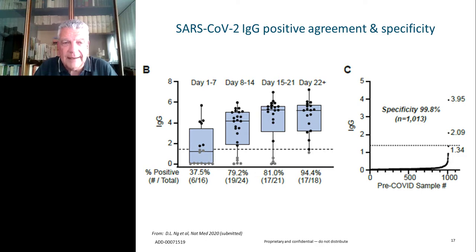This combines the detection according to the weeks after the onset, you see here on the left, and the specificity of another cohort, very similar. And you see that the distribution is the same. The specificity is 99.8%. And again, there is just one sample that is across the cutoff area, which is this dotted line. Why am I pushing so much on specificity?